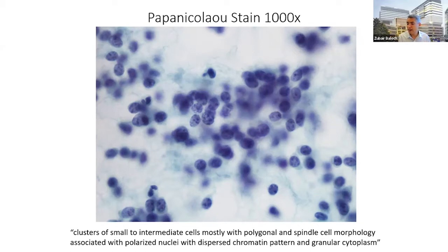And that is kind of reminiscent of what you see in plasma cells. So if you remember your medical training, when you're looking at blood smears and you look at the plasma cells, the nucleus was always pushed to the edge of it. So that's called the plasmacytoid appearance.